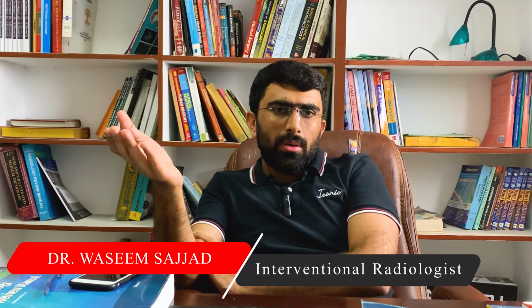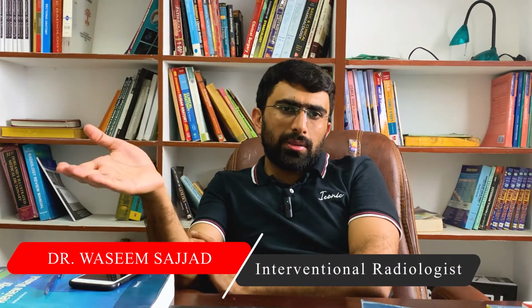If we repeat these signals, in hyperacute form, only T2 is hyperintense, T1 is hypointense or isointense. In acute form, the T1 is still hypointense or isointense, and now the T2 sequence is also hypointense. In subacute forms, in early subacute and late subacute, the T1 sequence is hyperintense.